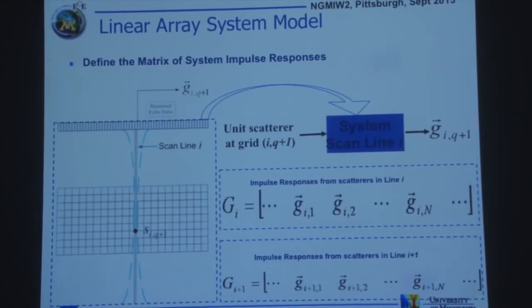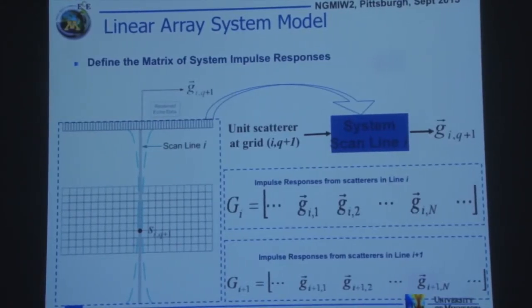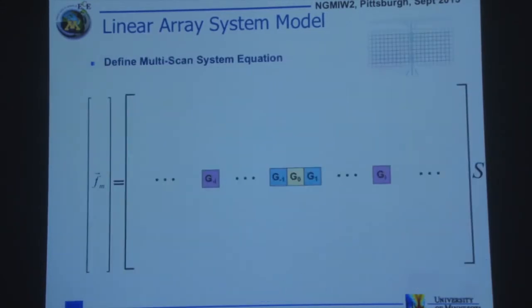But as you can imagine, you have a lot of grid points. So if you will forgive me, I'm just going to show you what has been done, because there's a lot of math behind this. But it leads to a very nice result, which is, in 2D, I can account for both the side lobes of the beam and the axial response of the system, and form a matrix equation.